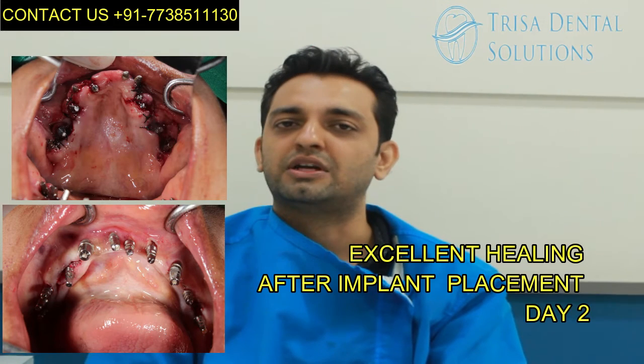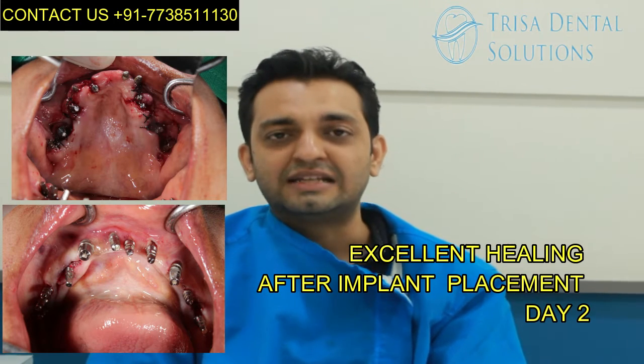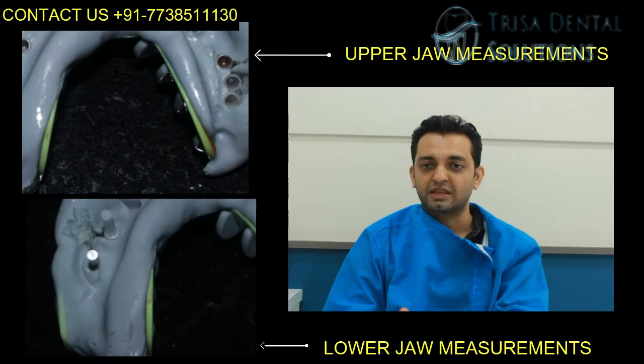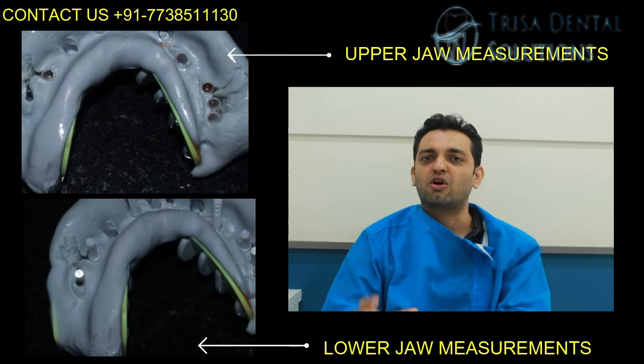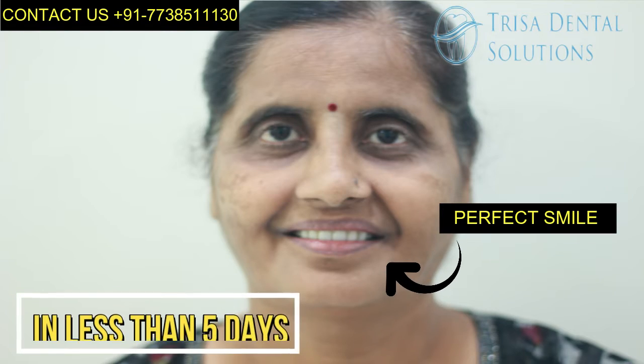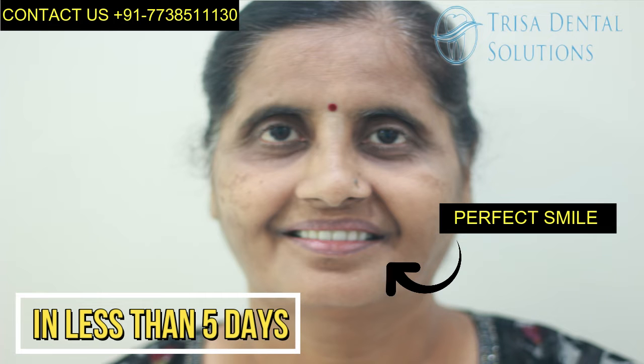Except for that one implant, all the other implants were placed flapless in the mouth. The beauty of this system is that once the implants are placed, you don't have to wait three to six months and you don't have to do bone grafting — you can immediately start taking measurements. As you're seeing on day two and day three, all the healing sockets are perfectly fine with not much pain or swelling. After a series of measurements, in less than five days we could give her a perfect new set of teeth.